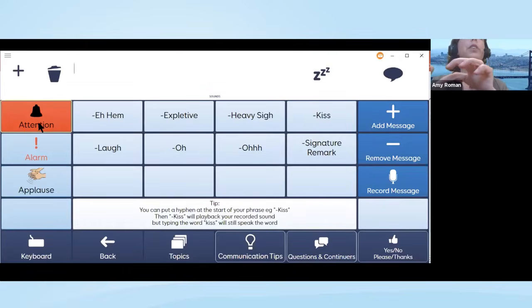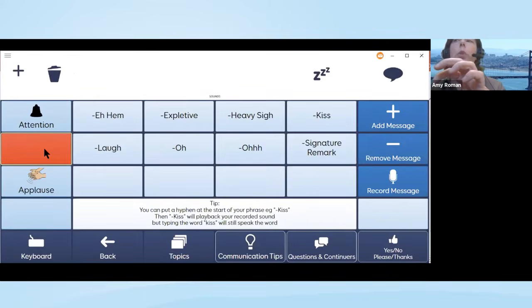And then I also have an alarm that's louder, a little more obnoxious, and that's for getting someone's attention maybe in another room. It's a real call chime, like you need something. And it will go until you turn it off. Okay. All right.